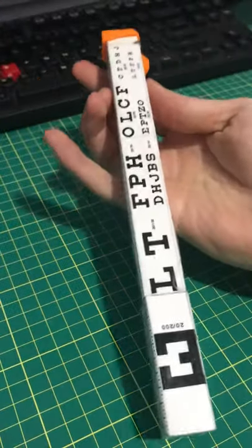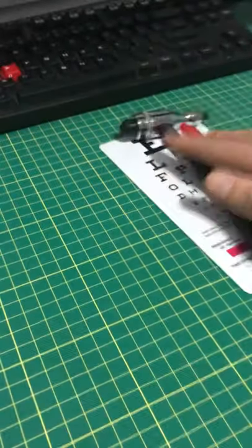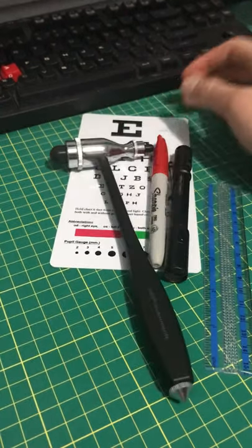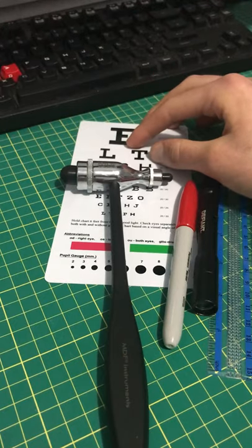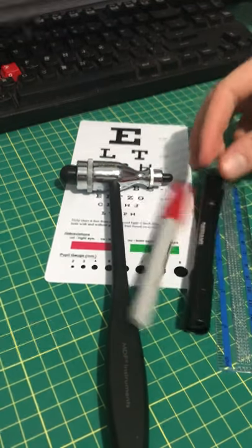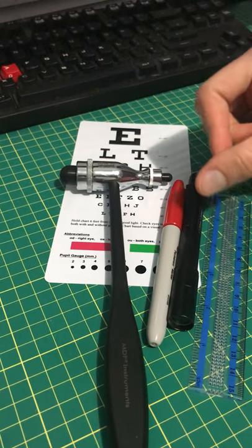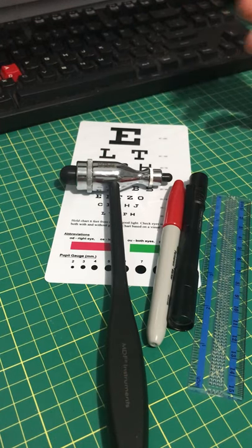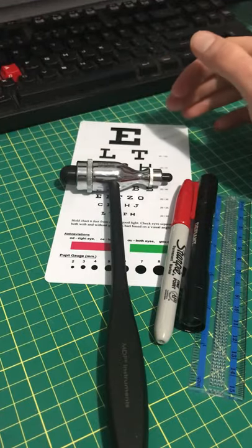In contrast to all these individual tools: the reflex hammer itself costs like 30 bucks, this eye chart costs like 10 bucks at the campus bookstore, this pen light costs like 10 bucks, the ruler I had from a seventh-grade geometry set — probably five bucks or something from the drugstore — and pens you can just borrow. But you're looking at a decent amount of money here.